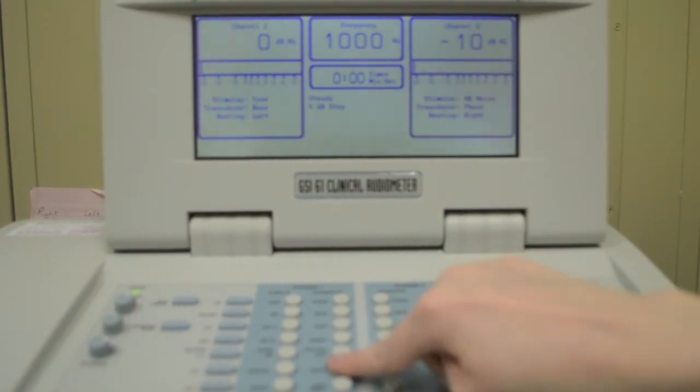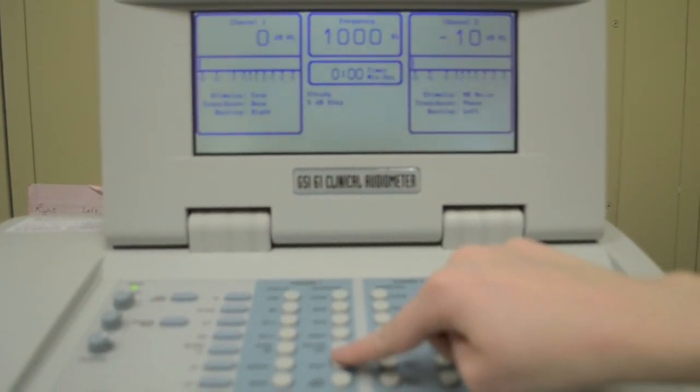Now, let's go through our step-by-step instructions for each part of our test.